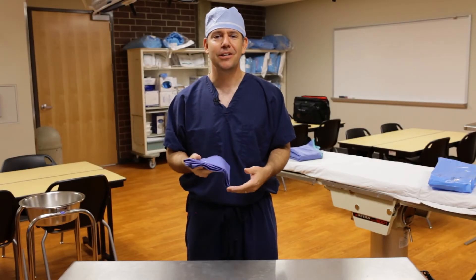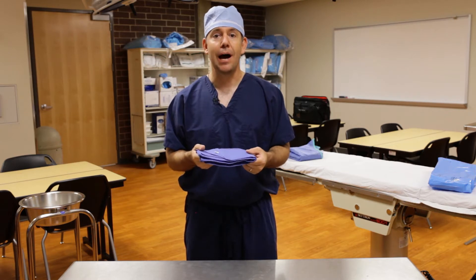Hey, good morning class. The last skill I want to show you is how to properly fold a surgical towel.